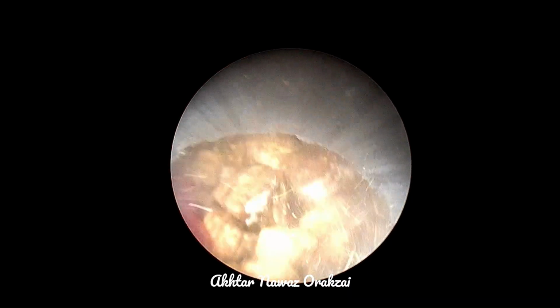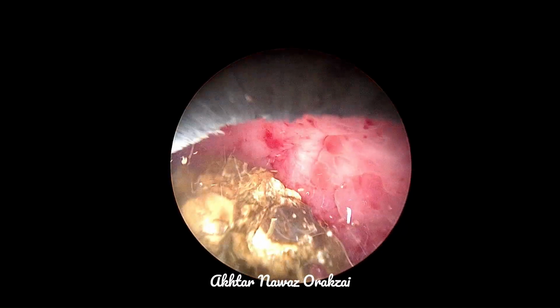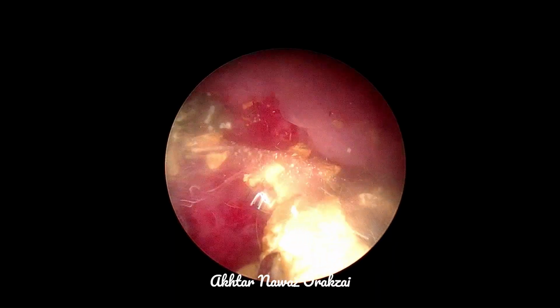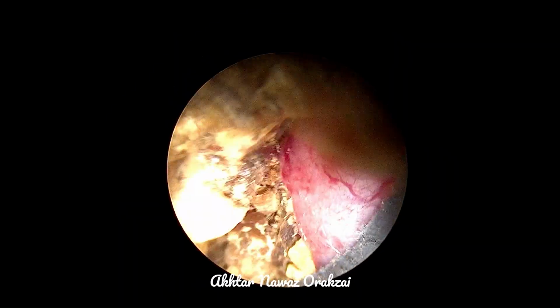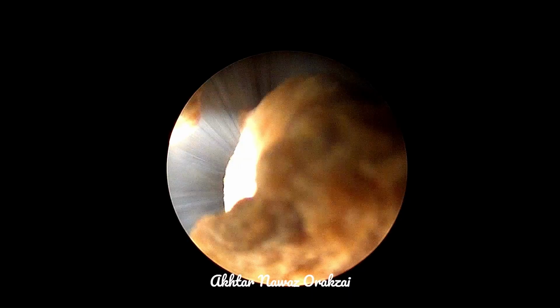Here, every now and then, when the stone is removed, we are able to see the bladder wall from the inside. You can see that there is severe hypertrophy of the mucosa, and there is inflammation, and there are small diverticuli, severe trabeculation, and also in a while we'll be able to see the bladder neck from the inside, and it will clarify the high bladder neck as well as the median and lateral lobes of the prostate.